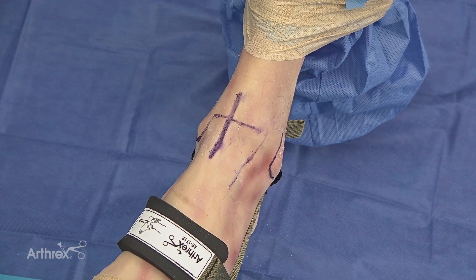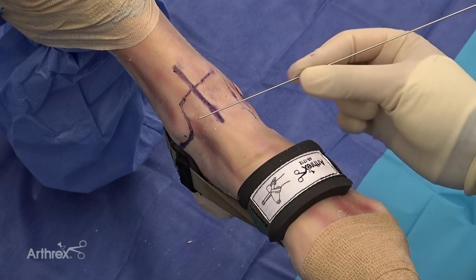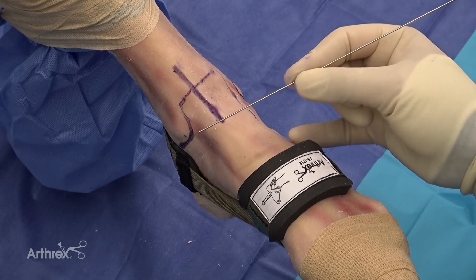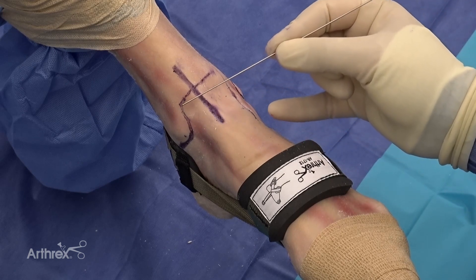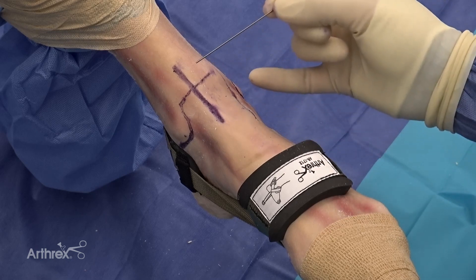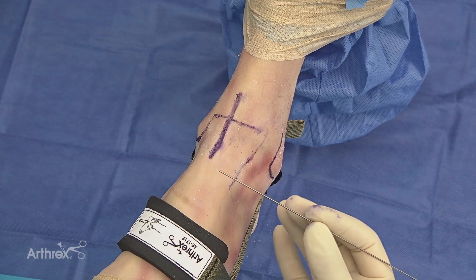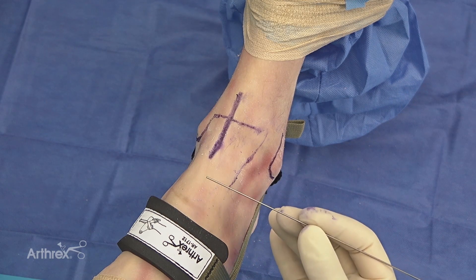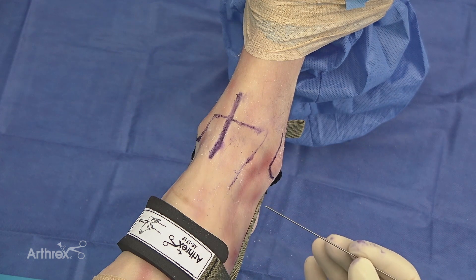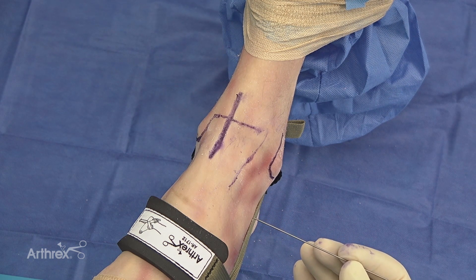Once the ankle is in distraction, I'll mark out the fibula as well as the medial malleolus and the anterior medial portion of the malleolus up into the tibial plafond, followed by the tibialis anterior. These are important landmarks when establishing ankle arthroscopy portals, as your tibialis anterior landmark will help guide you for your anterior medial portal, and we want to avoid injury to the superficial peroneal nerve when establishing our anterior lateral portal.